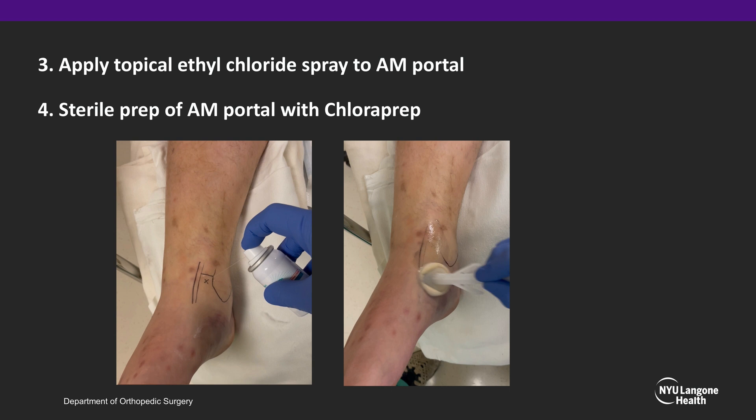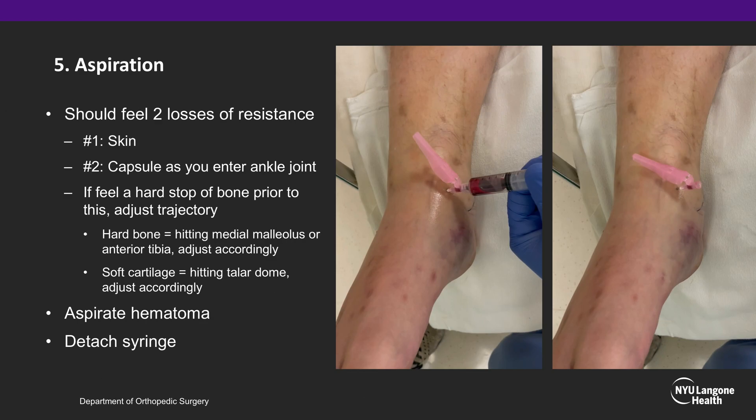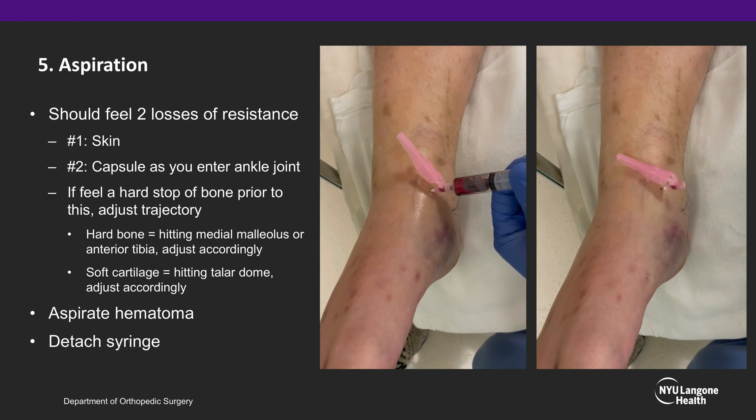Apply topical ethyl chloride spray to the anteromedial portal, and a sterile prep is performed. Next, the aspiration of the fracture hematoma is performed. When going in with a needle, you should feel two losses of resistance: the first at the skin and the second at the capsule as you enter the ankle joint.